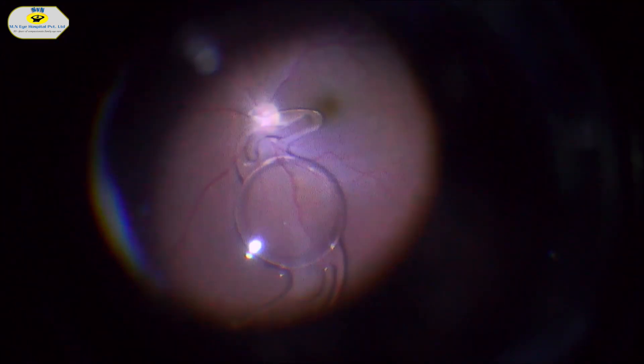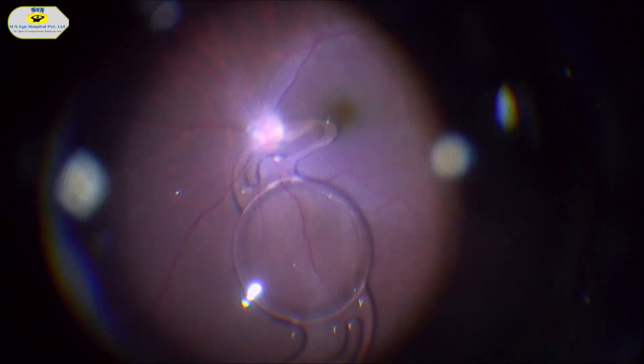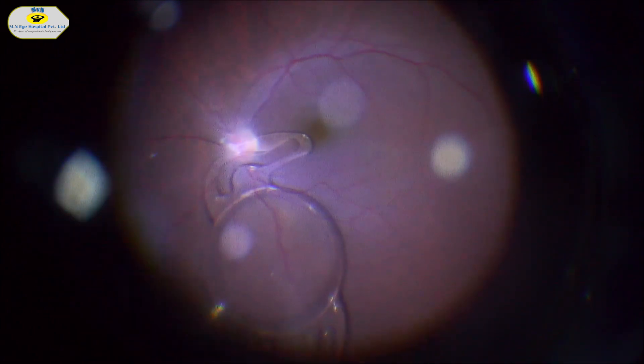Posterior vitreous detachment is usually induced after core vitrectomy. The main goal of the PVD is to reduce traction forces acting upon the retina, mainly done to prevent any retinal tears. After vitrectomy, we can see the single-piece acrylic foldable intraocular lens sitting on the retina over the optic disc.